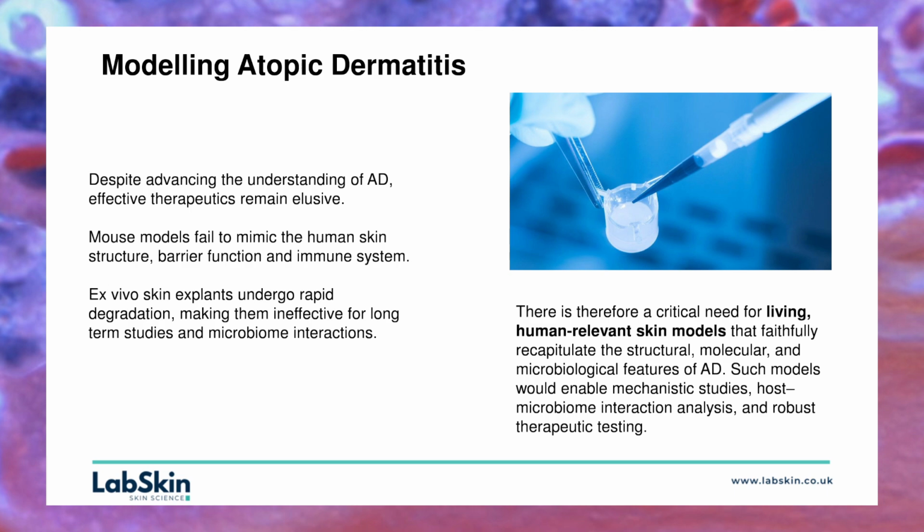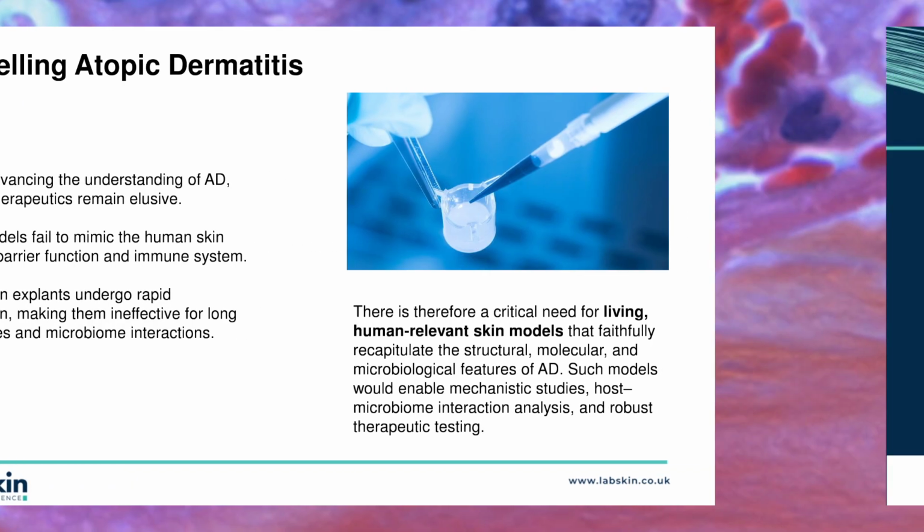Despite advancing the understanding of atopic dermatitis, effective therapies remain elusive. Mouse models fail to mimic the human skin structure, barrier function and immune system. Ex vivo skin explants undergo rapid degradation, making them ineffective for long-term studies and microbiome interactions. Therefore, there is a critical need for a living human relevant skin model that can faithfully recapitulate the structural, molecular and microbiological features of atopic dermatitis. Such models would enable mechanistic studies, host microbiome interaction analysis and robust therapeutic testing.